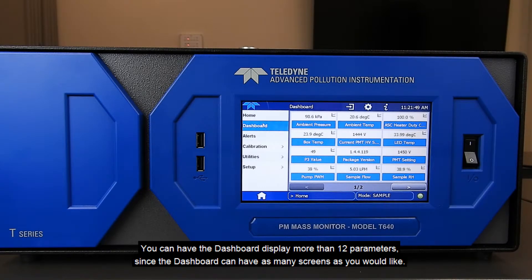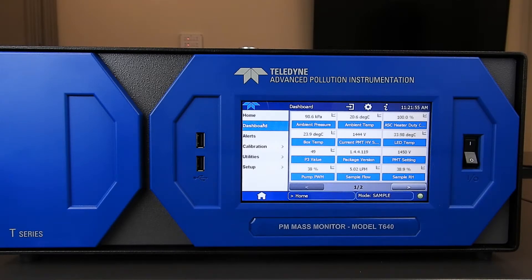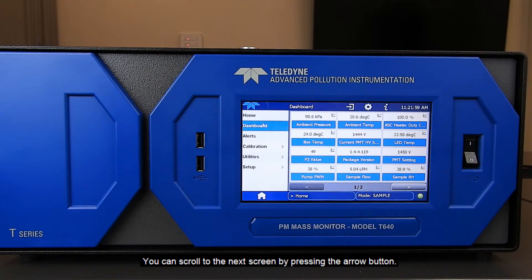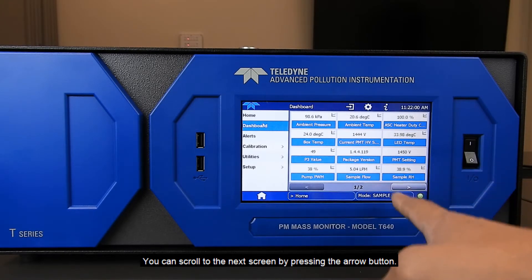You can have the dashboard display more than 12 parameters, though, since your dashboard can have as many screens as you would like. You can scroll to the next screen by pressing the arrow button.